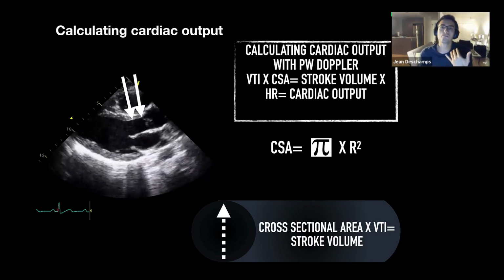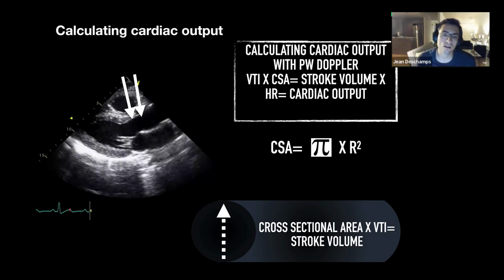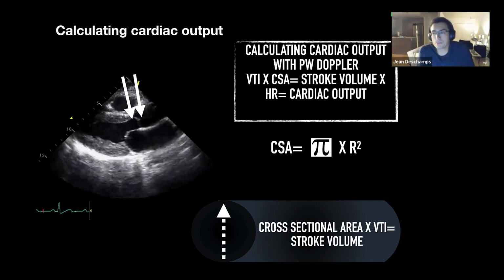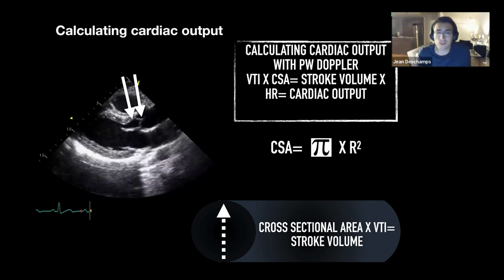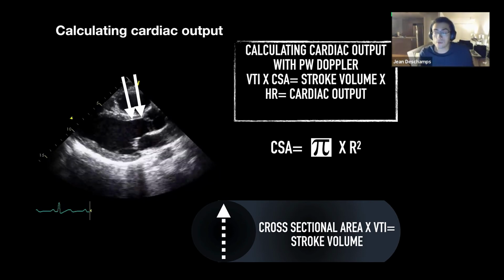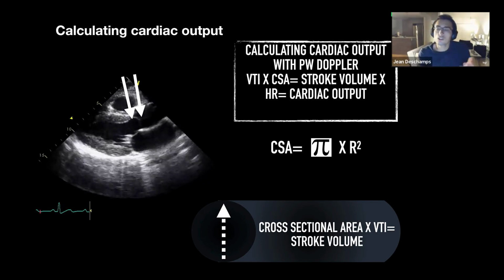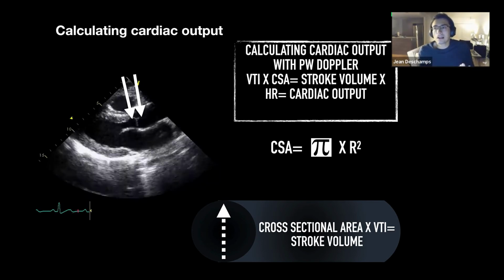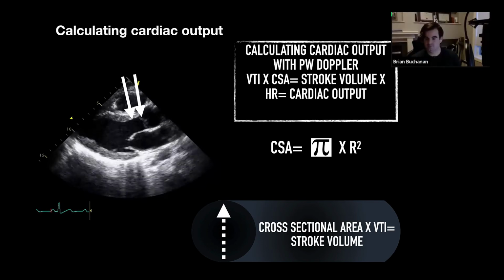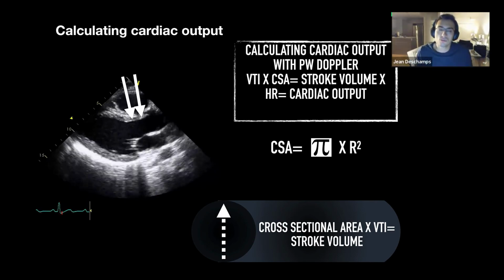If you look at body surface area and size estimations and rules for LVOT diameter, you end up realizing that most people are around 20 to 22 millimeters. There are extremes when they have pathology of the aortic valve or very small people, but you usually see it visually in the 2D, and you can see these are the ones I need to measure if I want to get something a bit more precise. That would be my argument in terms of measurements.